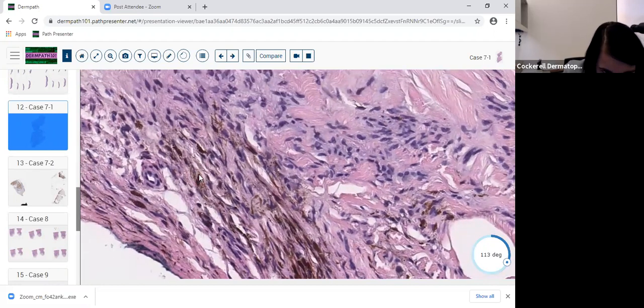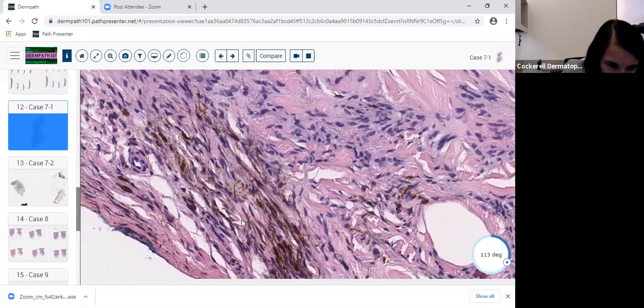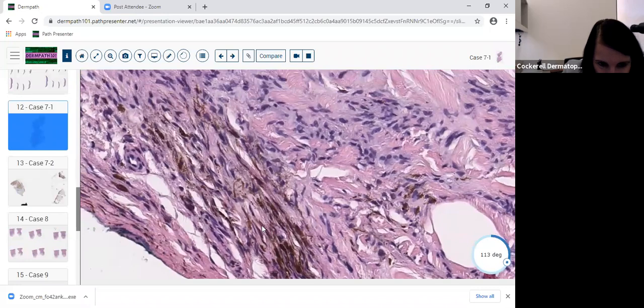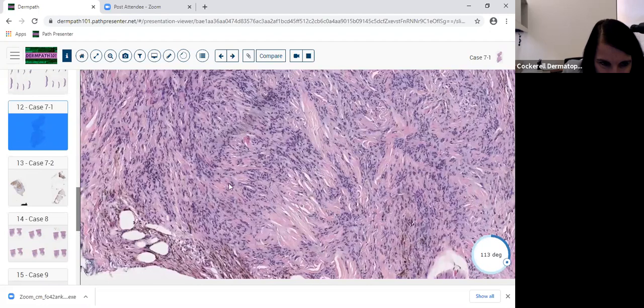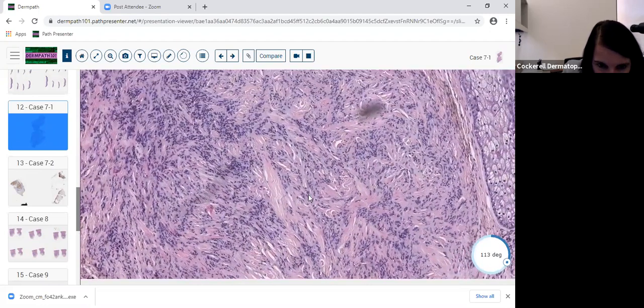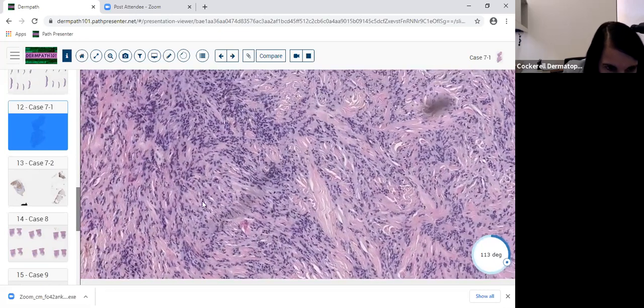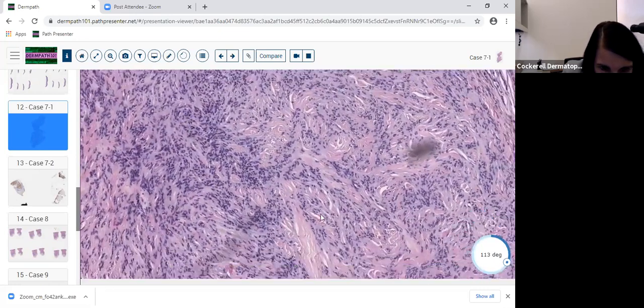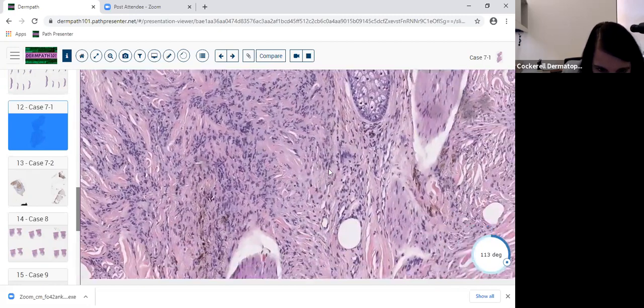And this is melanin, and these processes are slender and these cells are very long. And these processes are dendritic processes, so-called dendritic processes. And these cells, this is melanin. So right away, I'm thinking, you know, this is some kind of nevus. And I'm looking at the rest of the cells, which have no melanin, and the rest of the cells look somewhat ovoid, somewhat spindled. Here they're cut in cross section, so they look ovoid, and in other areas they look spindled because they're cut longitudinally.